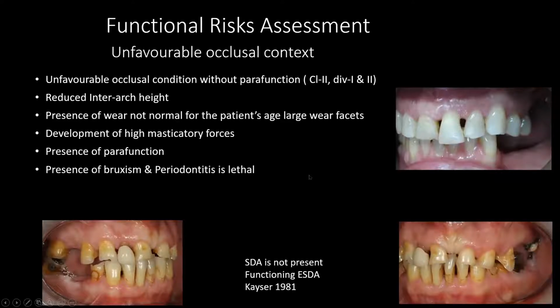Boyards has explained earlier. The problem I have is that these two patients are totally different things. This is a patient with a periodontal problem, with a collapsed arch, in a short dental arch, and you can see there's mobility of tooth number 2-1. While this patient's got very good bone support, minimal probing depths, severe bruxism, and tooth wear, but things have stayed pretty normal, with 1 or 2 caries that need to be resolved, but the patient's functioning pretty well. Got good periodontal support. So we have 2 different patients here.